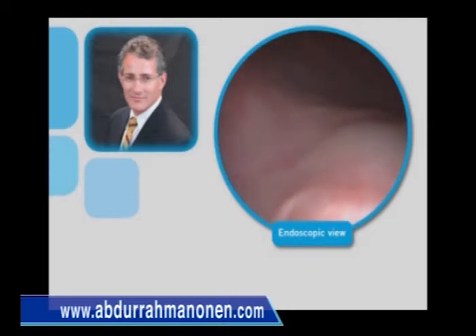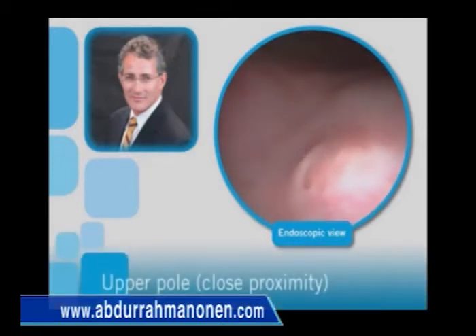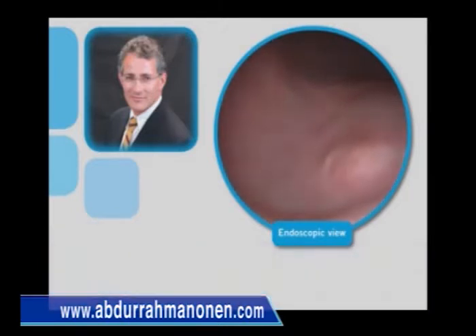The right ureteral orifice is identified here. It is difficult to identify the upper pole ureteral orifice, which is in close proximity. In these cases, it is sometimes helpful to use a catheter for purposes of identification.